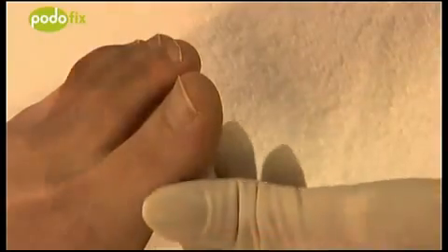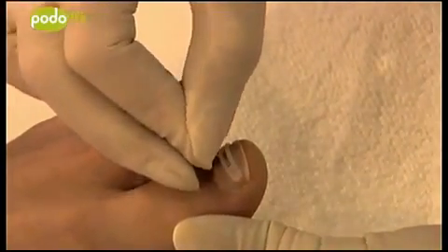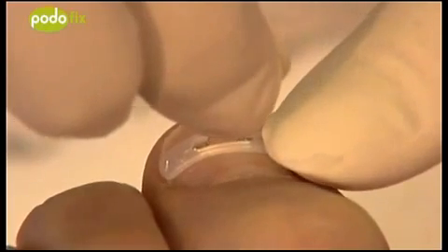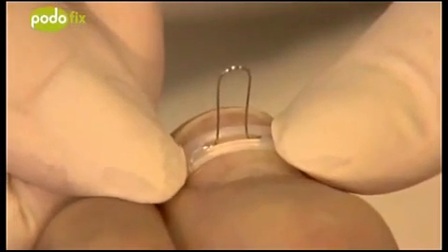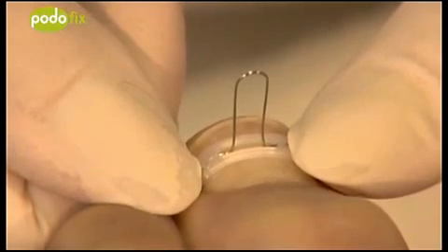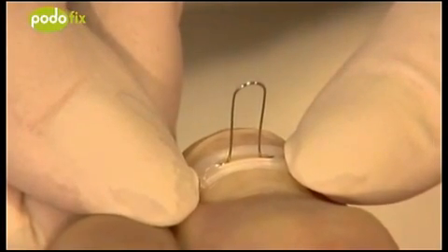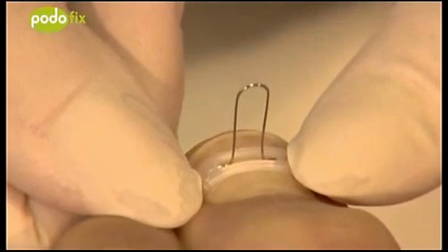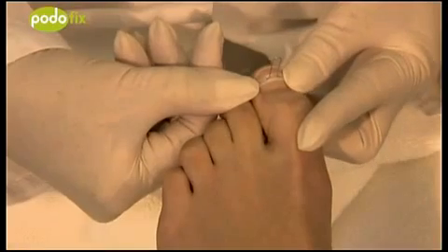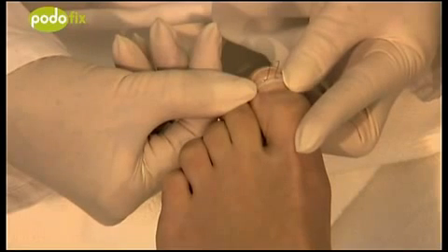Position the brace in the middle or on the side of the nail that is more strongly ingrown and place it carefully on the nail. Press down on the nail with your fingers for about 15 seconds and press down the brace at its edges as far as possible toward the nail creases, so that also the central part of the brace lies on the nail. Press primarily in the edge areas of the brace while doing that.